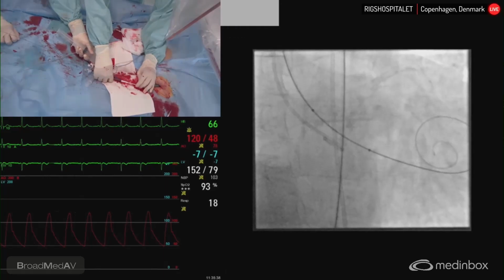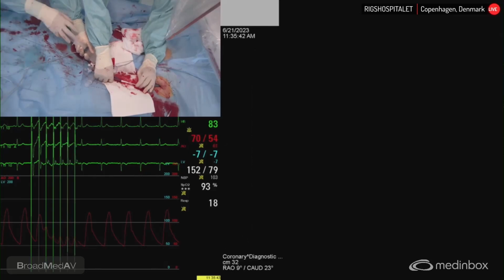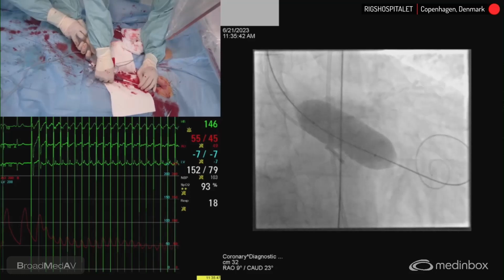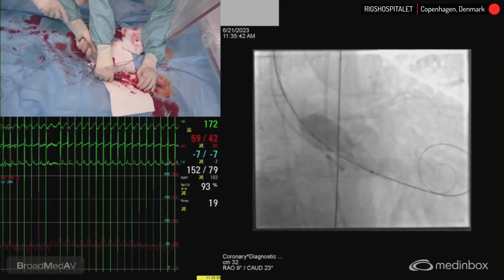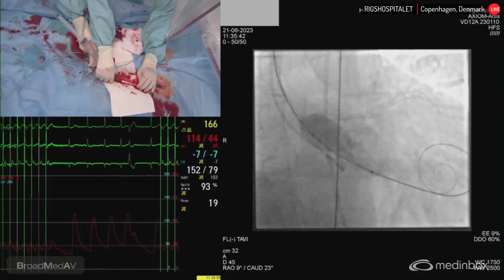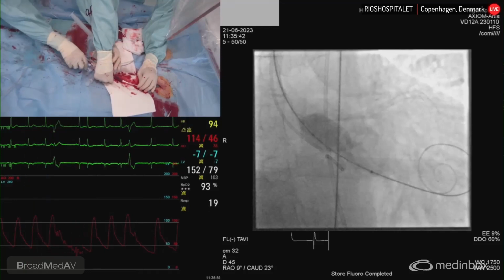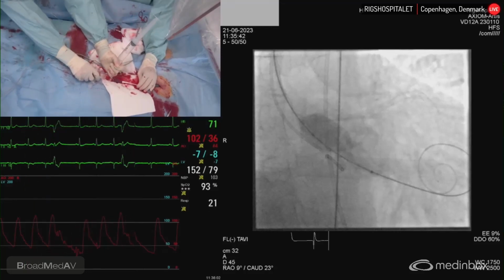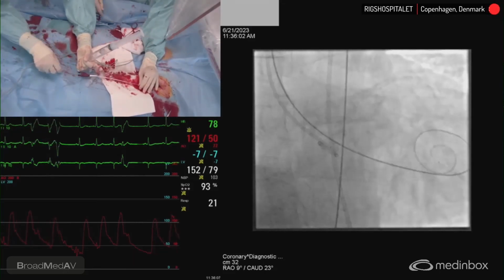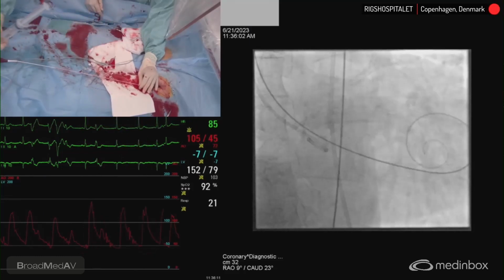Not a great thing here. Even worse. Yeah, it's good. Stop pace, please. I think that was a good, proper predil, and he has a good preserved rhythm, so we can walk it out. Okay. It's important we have a good predil here because we don't have any repositionability here. With the Acurate, it has to be directly good.